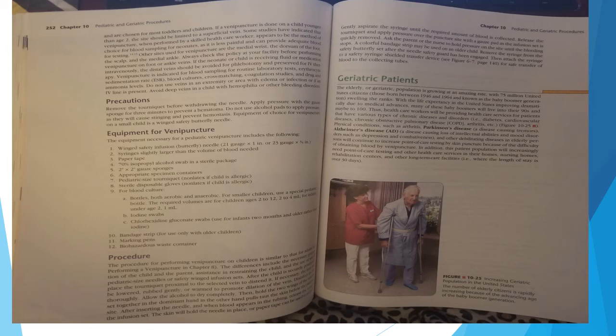For blood culture, bottles both aerobic and anaerobic. For smaller children, use a special pediatric bottle. The required volumes for children ages 2 to 12, 2 to 4 milliliters. For infants under age 2, 1 milliliter. Iodine swabs. Chlorhexidine gluconate swabs, used for infants 2 months and older rather than iodine. Bandage strip, for use only with older children. Marking pens and biohazard waste container.